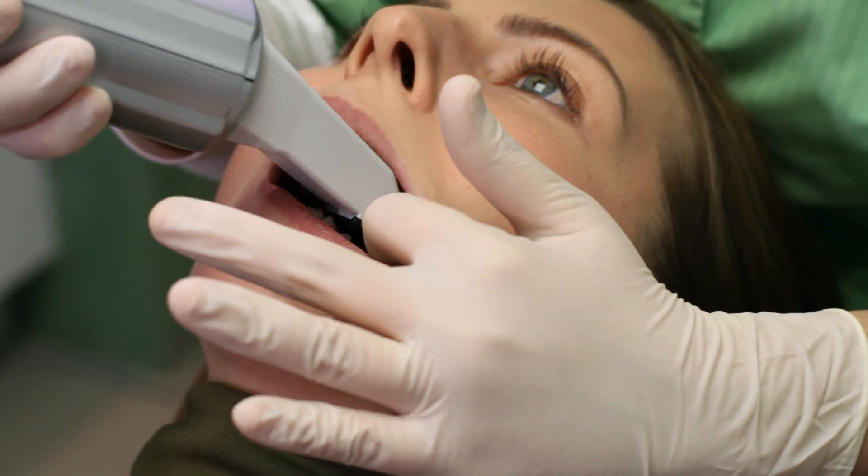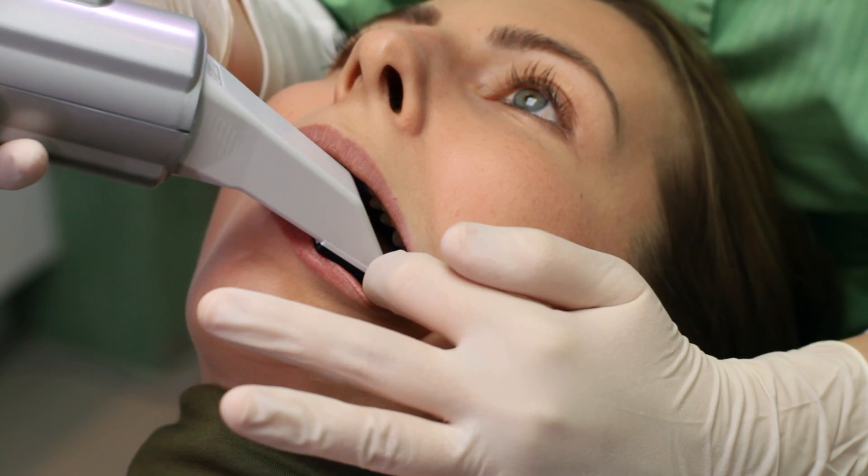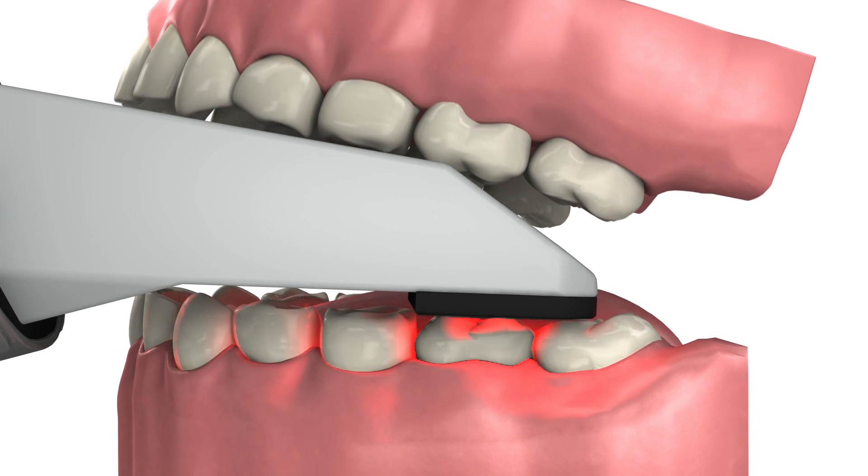It's not necessary for the patient to open their mouth very wide. In fact, it's not a problem if the patient bites down lightly on the probe during scanning.